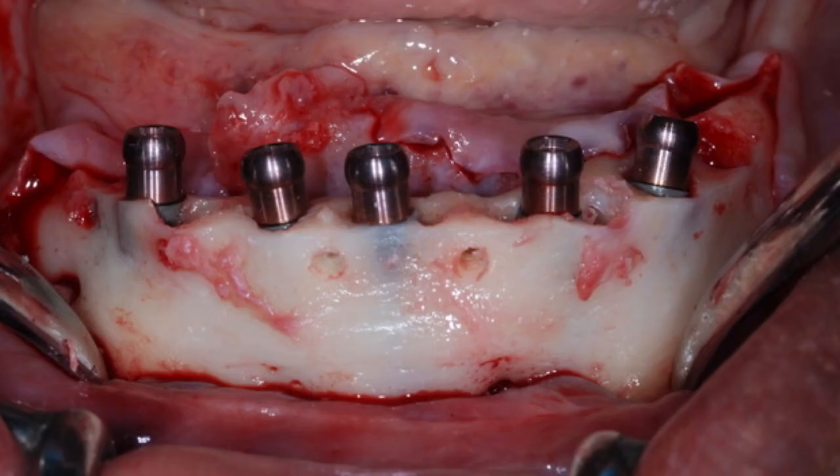So now here are the abutments that are placed. One of the things I've learned from doing several cases now with the system is that traditionally in our all on four, we like our posterior implants to be angled 30, 40 degrees, the tilted angle concept. And then we have different types of multi-abutments to convert and connect that. Well, one of the things I've learned with the abutments with the Zest system is we really don't have to do that much tilting.